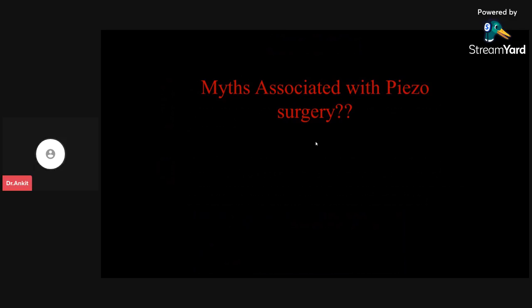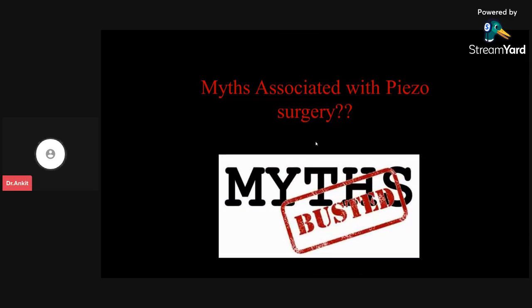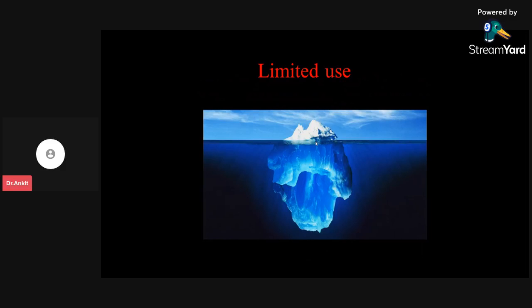so hopefully by this we have broken the myths that are associated with piezo surgery, right? Let us discuss the myths that are prevalent in the market. The first: it has a limited use. Obviously, it has a very vast area of usage. It is upon us how well we can use the piezotome, either in sinus surgery or in the different arenas we have already discussed. So I won't say that it has a limited use. In fact, it is not used as it should be.